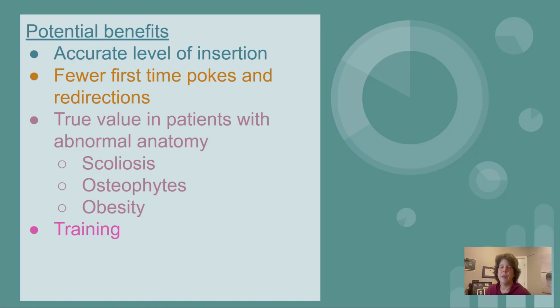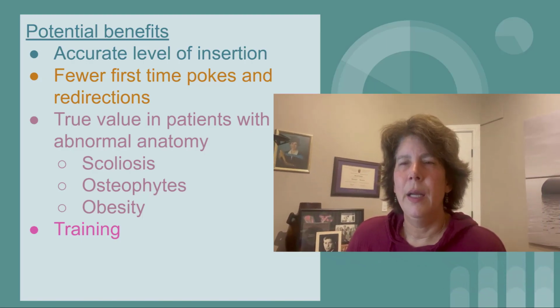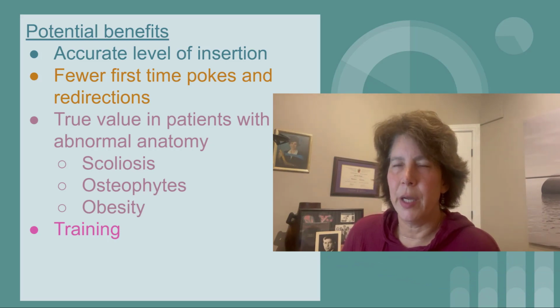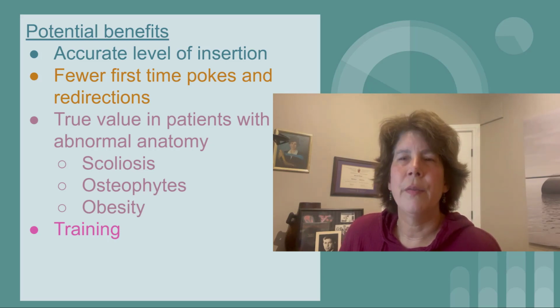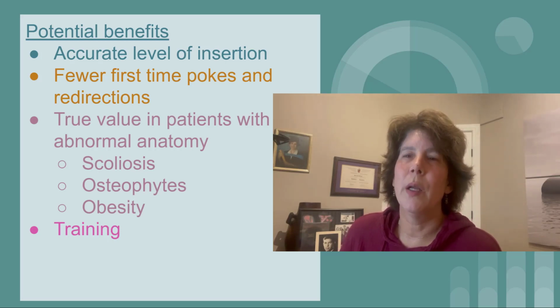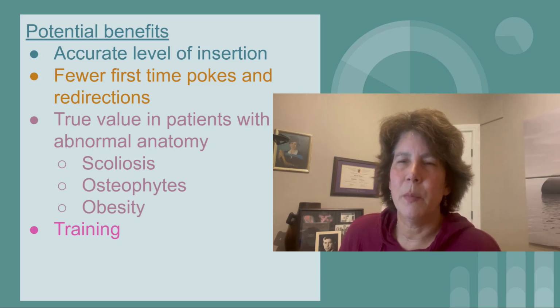So what are the benefits of doing it this way? My personal experience is this, that I have less digging around time. So in the more challenging backs, I have fewer first time pokes and fewer redirections. In the really hard backs, it does save a lot of time, and I feel safer knowing where I am. It's definitely helpful in training as well. When you landmark the back out and that resident starts digging around, you kind of have a sense of where the needle tip is, which is quite reassuring.